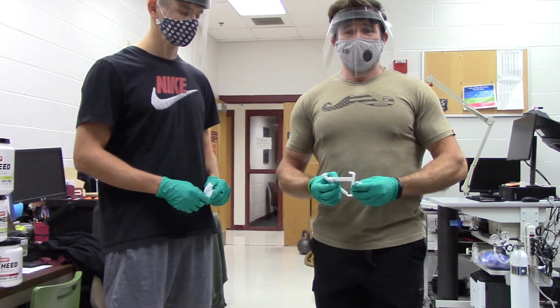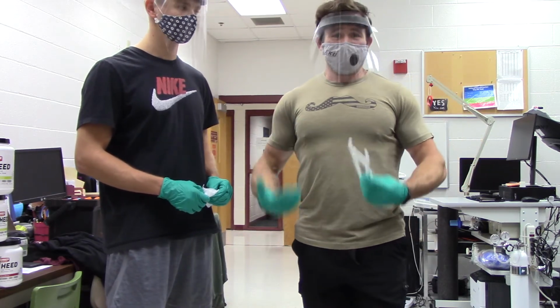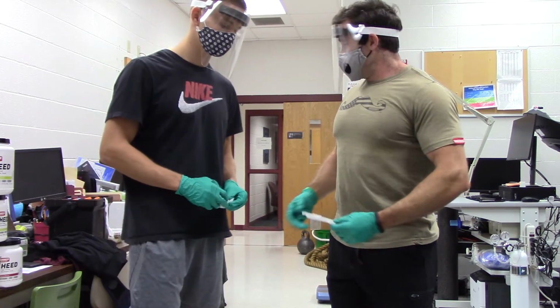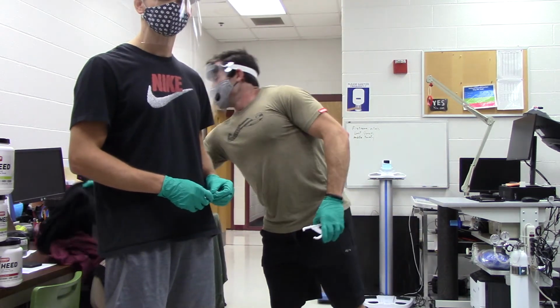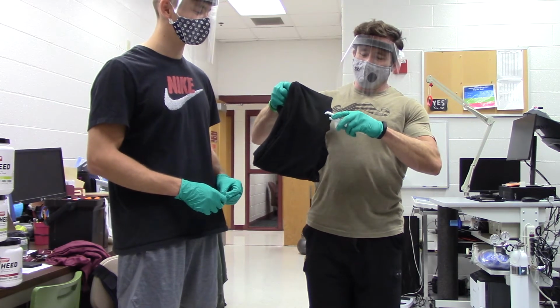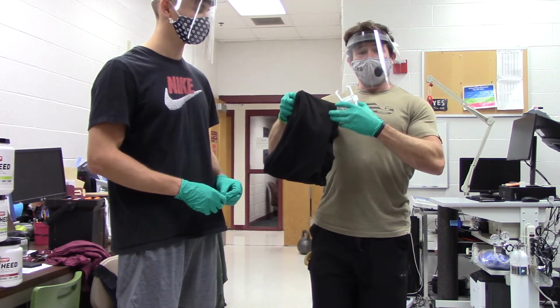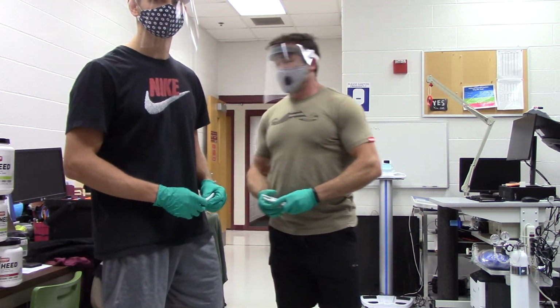Now for some folks, you have to grab a little bit harder. We're not going to worry about doing all this on the skin. We're just wearing clothing that makes it easy. If he was wearing like really thick sweatpants, like the ones you were kind enough to bring, we're actually going to measure the thickness of his sweatpants, which is going to be about 2 millimeters, and we're going to subtract 2 millimeters from all those scores when we go through there.